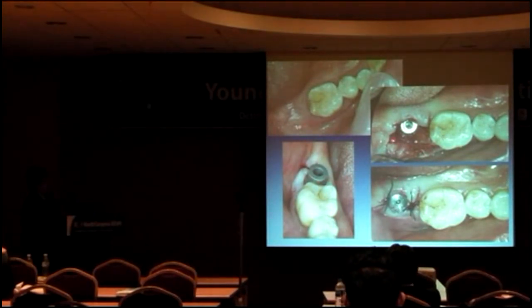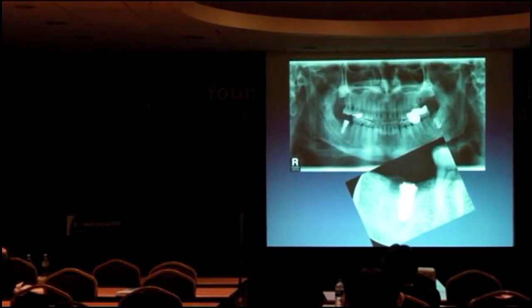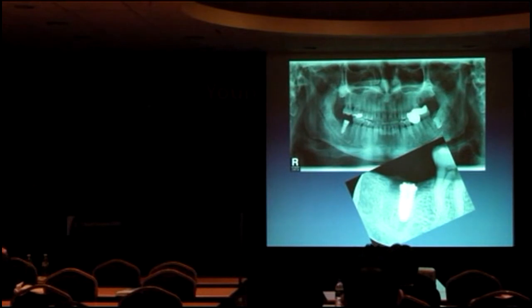You can still see the defects around the previous socket. After I placed the implant, before the bone graft, I connected the scan body and scanned it, and then I finished the graft and connected the healing abutment. This is how it looks right after the placement.